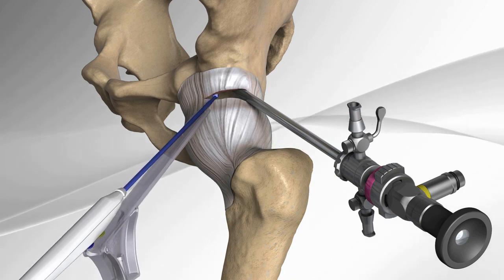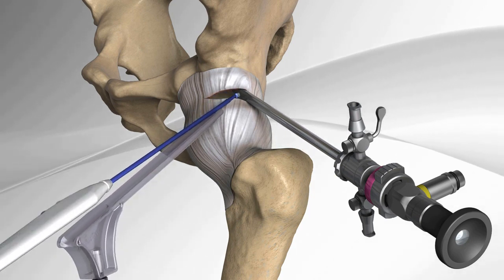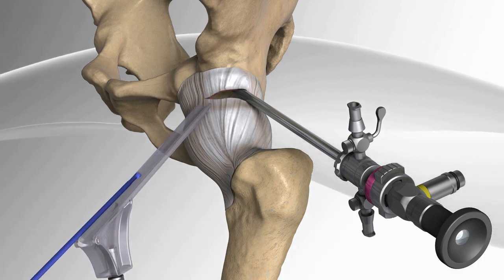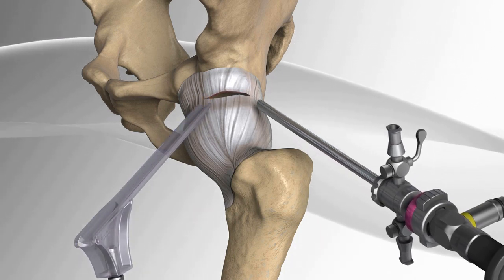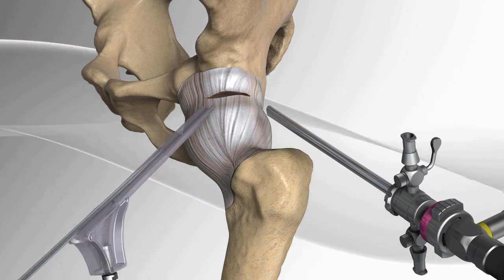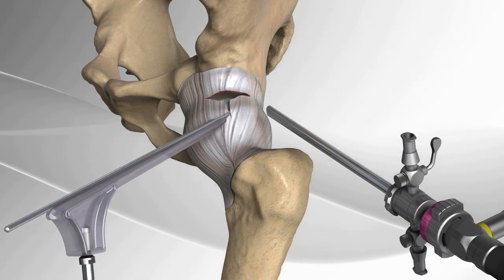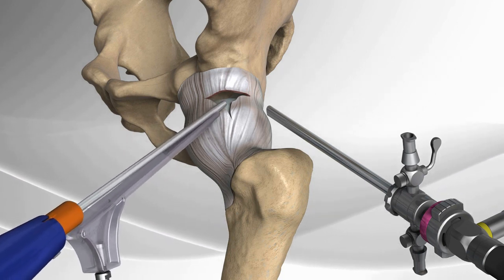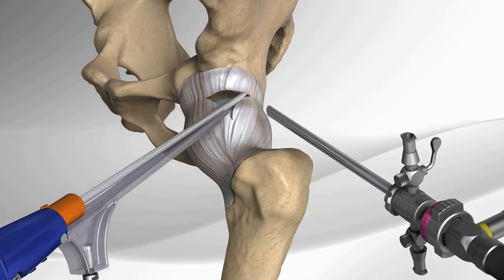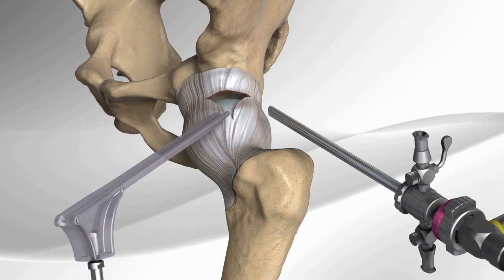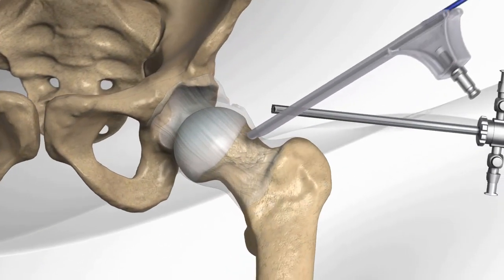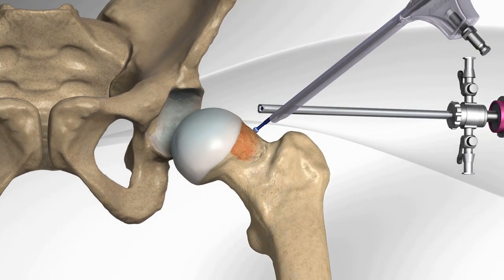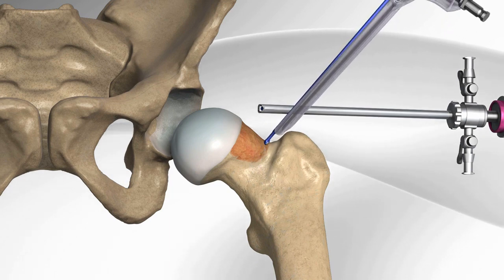A radio frequency device can be used to control bleeding. A longitudinal split is made in the capsule over the cam lesion and a shaver is introduced to clear an opening for the surgeon to perform the resection. The cam lesion is exposed and inspected. An arthroscopic burr is utilized to remove the cam lesion and restore a more normal shape to the femoral head and neck.